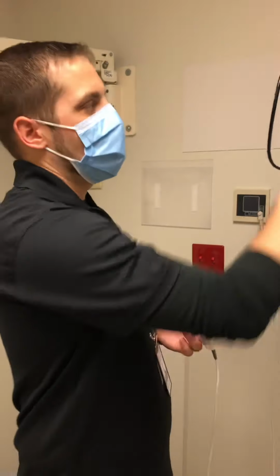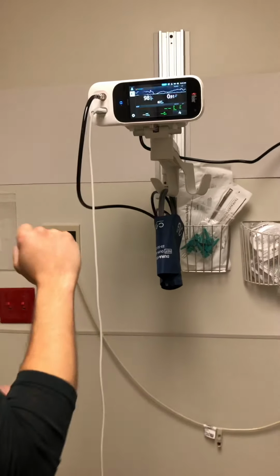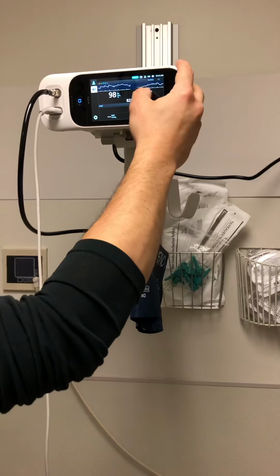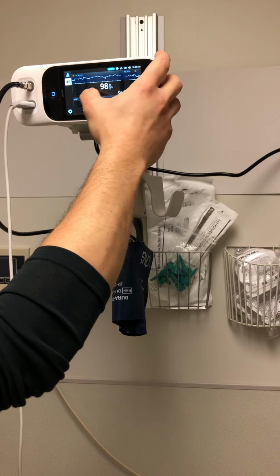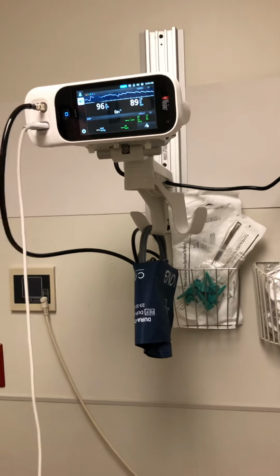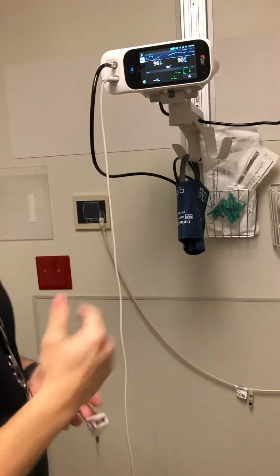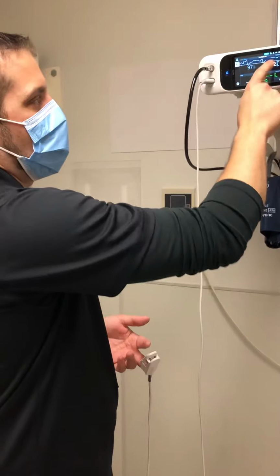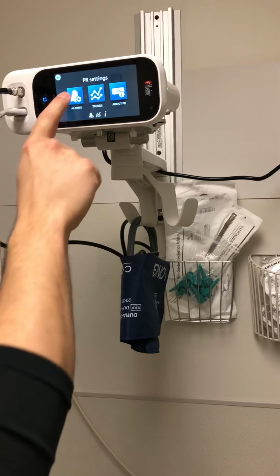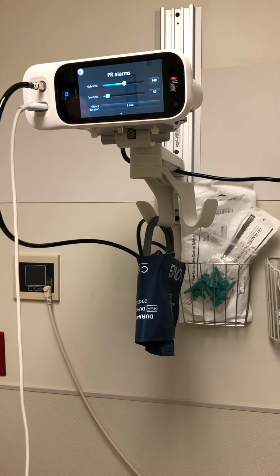Defaults meaning your alarm settings for SpO2, your default is 88%, okay? For pulse rate, let me pull that back up so you guys can see it. For pulse rate, your low is 50, your high is 140, okay? To make an adjustment on any of the parameters, you just touch on the parameter that you want to change. So for pulse rate, let's just say, you touch on the parameter, you go into the alarms menu. There's 2 ways to make the adjustment.